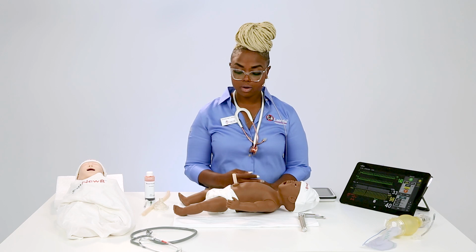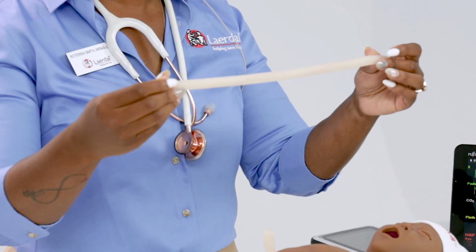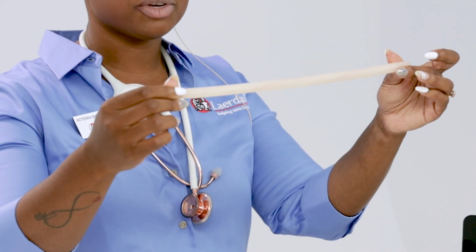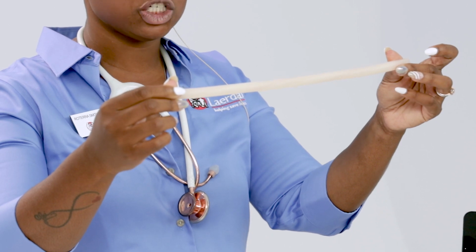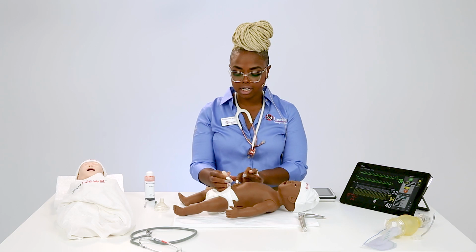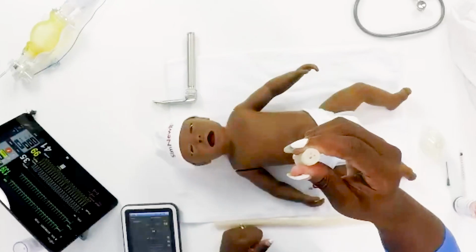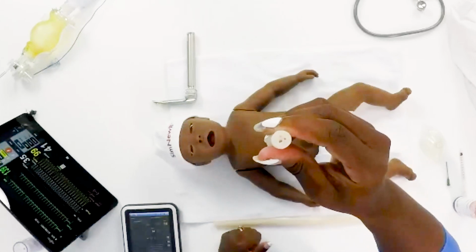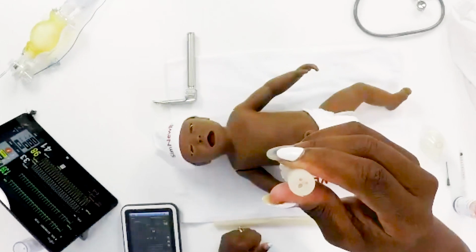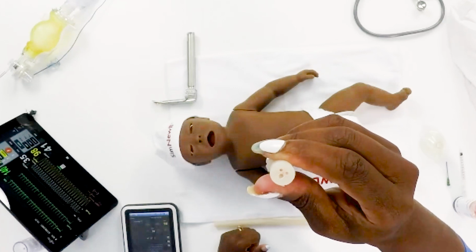Yes, absolutely. As you can see, we have an umbilical cord. Your set comes with quite a few, and those look like this. You'll take your trauma shears or some household scissors and cut it to your desired length. After you do that, you'll put some lubricant on here and insert it in this hole if it does not go smoothly. Then if you look here, you are able to see that you have 2 arteries and a vein to cannulate. So yes, you are able to put a catheter in there and infuse those fluids at whatever rate or volume you need to.